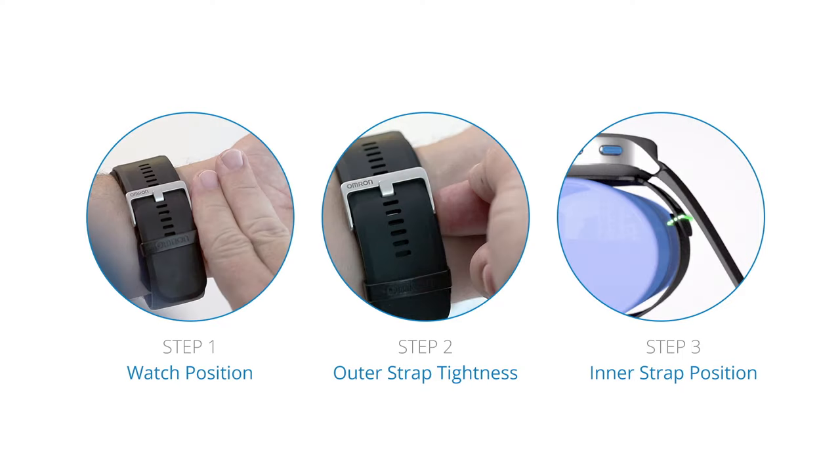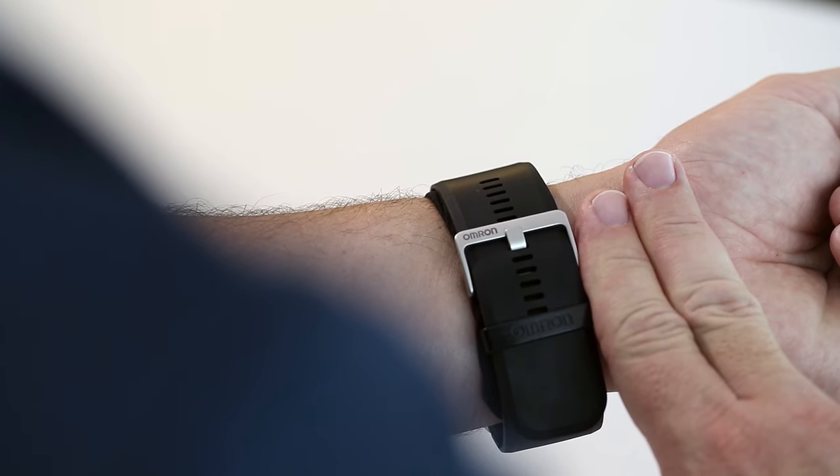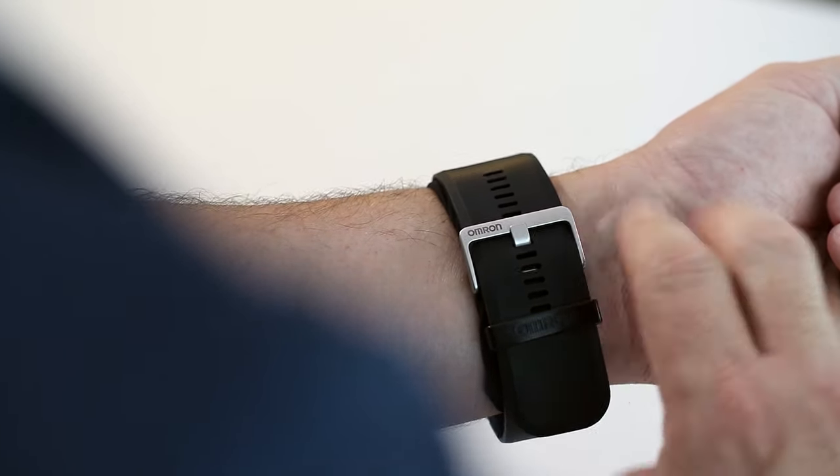There are three important items to check prior to recording your first measurement. Step 1: Using your index and middle fingers together as a guide, leave approximately one inch between the edge of the band and the bottom of your palm.